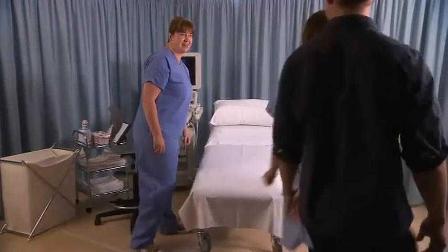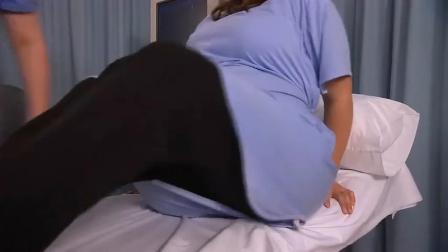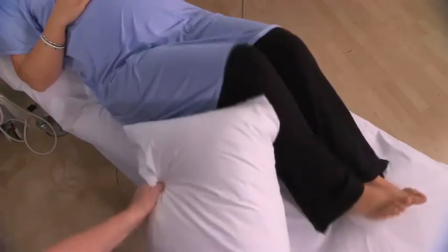Introduce yourself to the patient and her companion, if present, and ensure the patient is suitably dressed. Position the patient ready to perform a transabdominal scan.